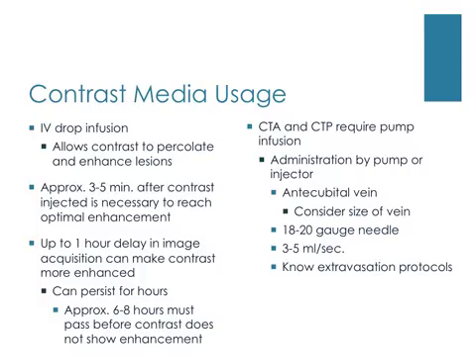The technologist needs to be extremely careful as to not extravasate contrast into the arm during this procedure. The volume injected per second into the vein should take the vein size into consideration. So if you have an elderly patient who has weak veins, or even a cancer patient who has weak veins usually, you need to make sure that you don't blow the vein by sending too much contrast through the IV too quickly. You'll sometimes need to back off on your flow rate.